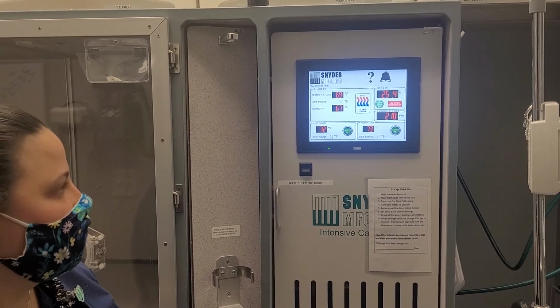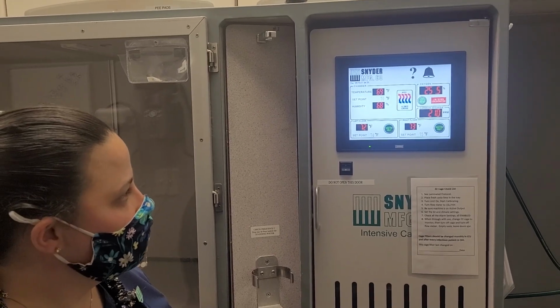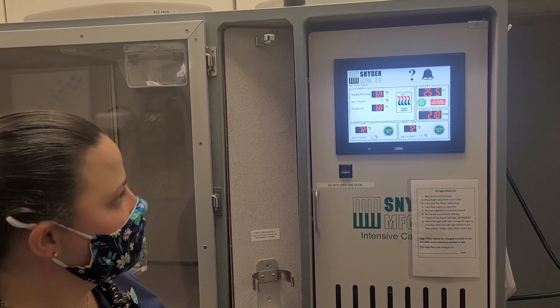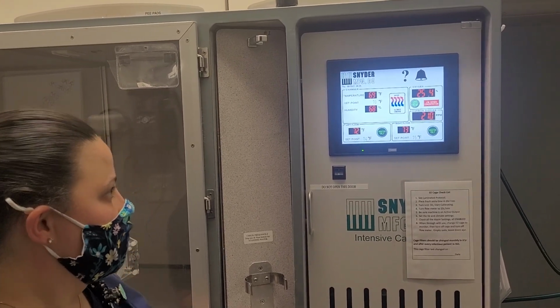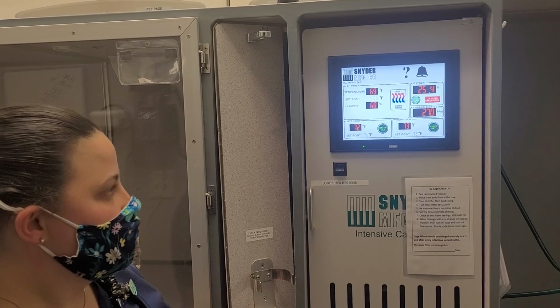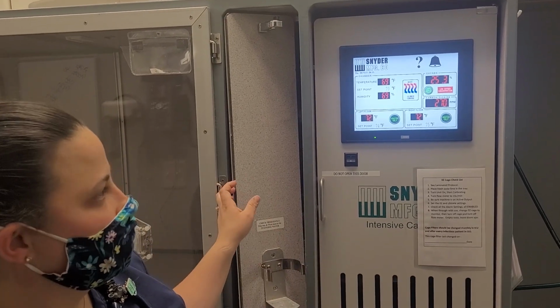It's just going to fly now. There it goes. We're going to do a really exaggerated leak.